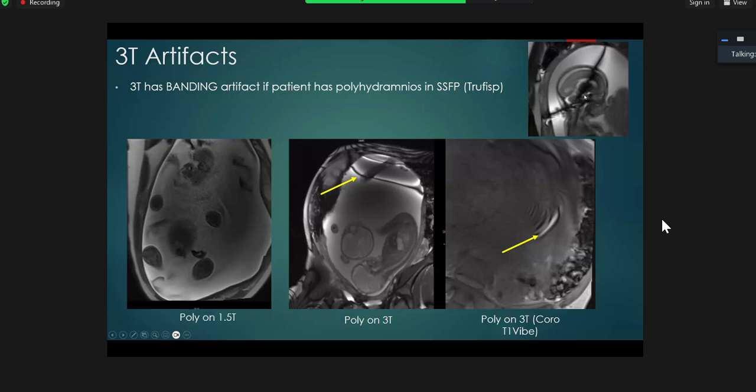Here you go. So really, you're not going to be able to say much on the sagittal, but you can say grossly, but that's not the value. It's really at the edges of the field of view and at the tissue interfaces that this banding occurs.